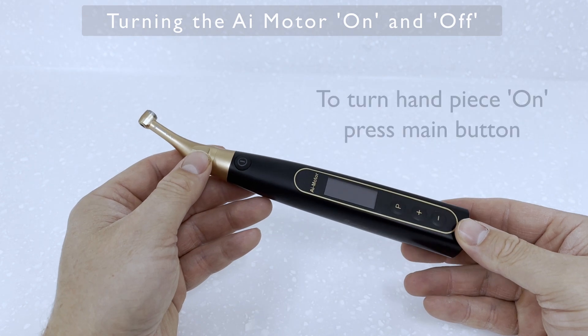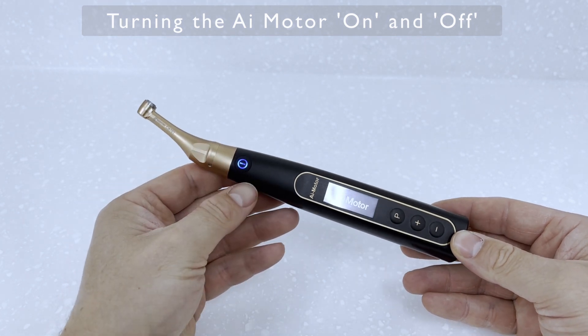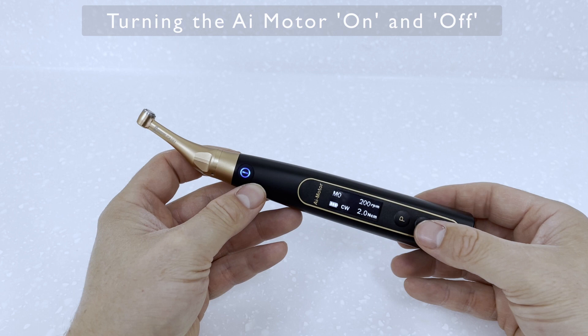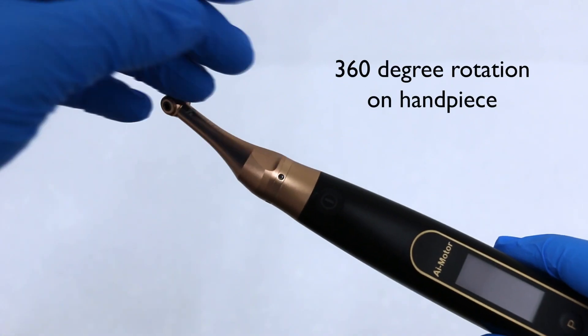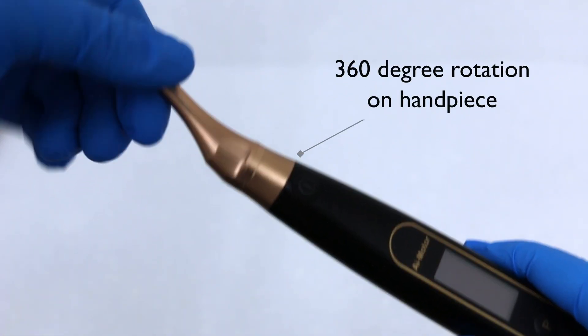To turn the handpiece on, it's very simple — just press the main button. To turn the handpiece off, press the P button first, and then straight after press the main button. Also worth mentioning: the removable handpiece turns 360 degrees.